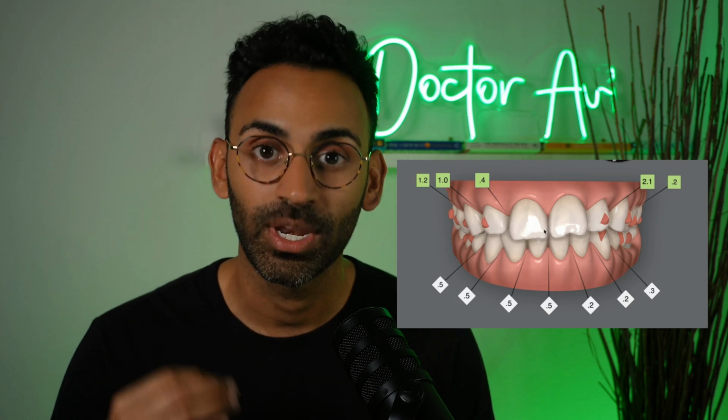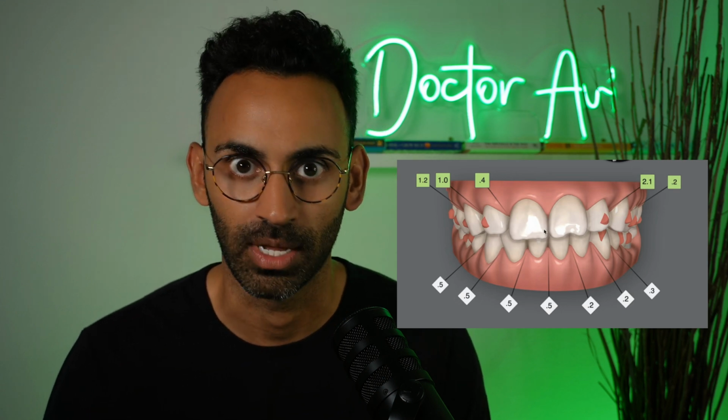Just because a patient asks you to treat them with clear aligners does not mean you should do it. General dentists should not be taking on every single case that walks through the door. This is an example of a case that I would heavily consider referring to an orthodontist. I break it down and show you everything that I'm thinking about when I look at these types of cases and the different things that you should also consider when looking at clear aligner cases.